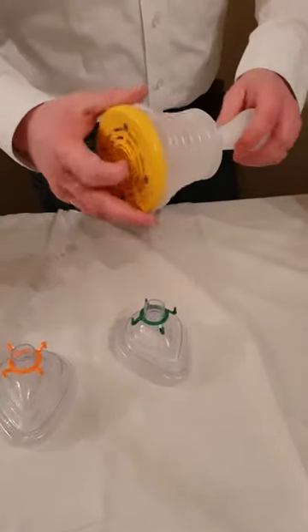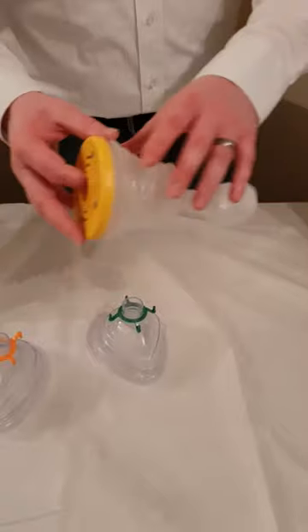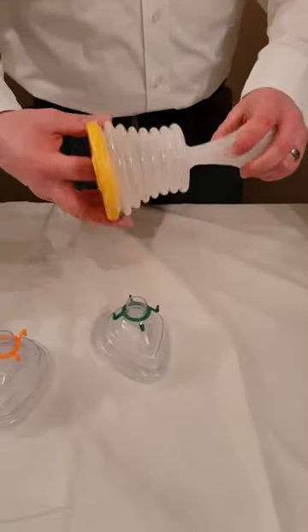Hi, just want to do a quick video demonstrating our new translucent LifeVac. It's exactly the same as before — the only difference is we have translucent bellows. This means if the obstruction comes up into the bellows, you can easily see it.